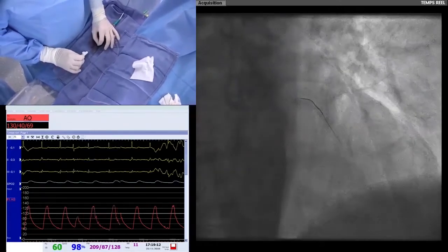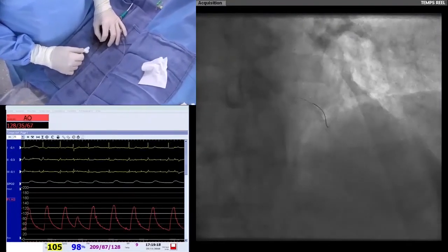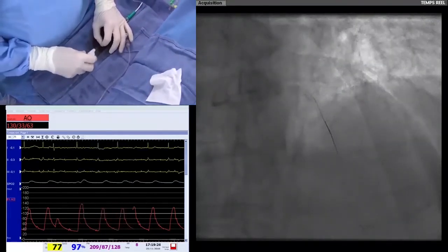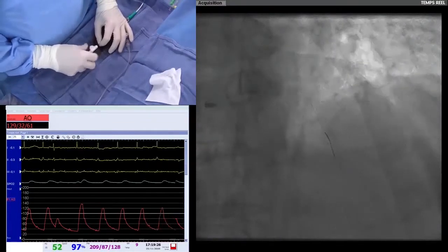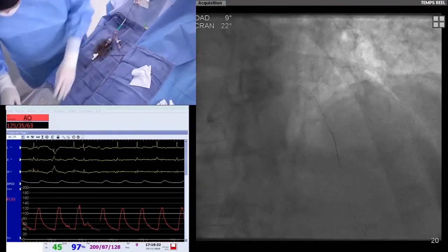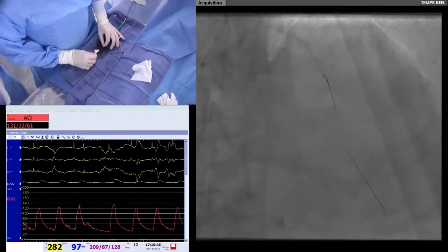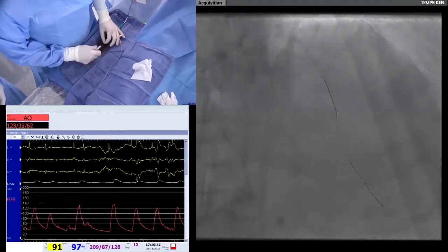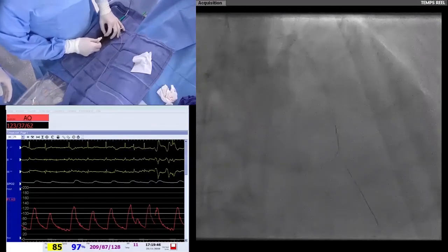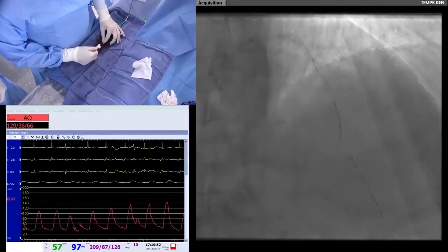So let me just share with the colleagues the tips and tricks of Nicolas. Looking at the table from above here, I can tell you Nicolas is moving the rota wire with the use of the rota wire clip. To avoid buckling this long rota wire, Nicolas preferred to leave it within the plastic hose of the wire itself. It prevents the wire from being kinked. It's a more than 3 meter long wire and might easily fall down the table, but by doing so, Nicolas has secured the rota wire. Of course, we pay a little price in terms of torqueability, but you see, he's managing pretty well.